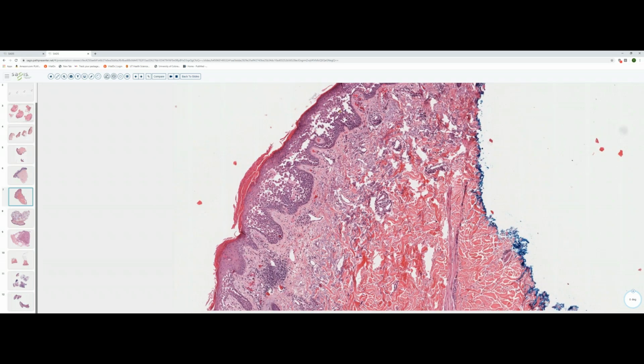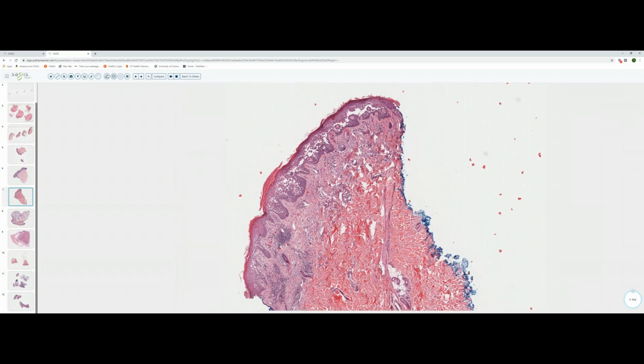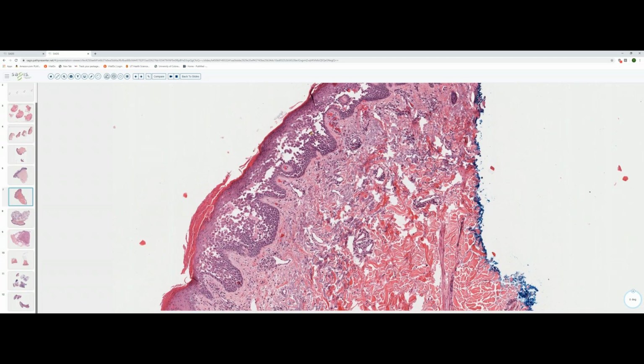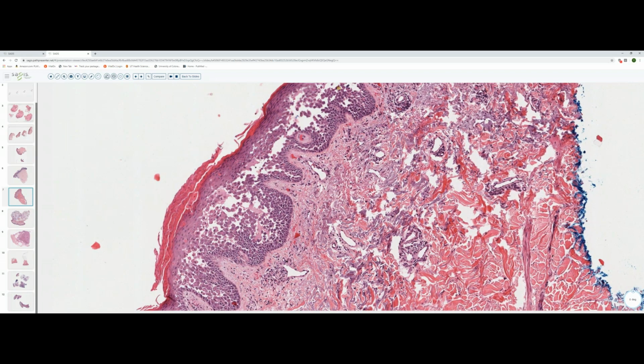The epidermis here is acanthotic, and this is an example of Hailey-Hailey disease, where we get suprabasilar acantholysis in an acanthotic epidermis, with acantholysis involving much of the thickness of the epidermis, but no appreciable dyskeratosis. This gives you the so-called dilapidated brick wall. Another metaphor that I've heard used here is leaves falling off a tree. And these acantholytic keratinocytes do kind of look like a tree dropping leaves in fall.